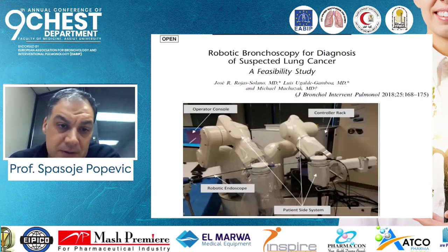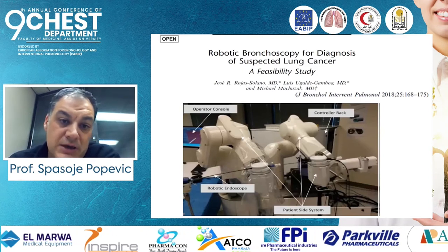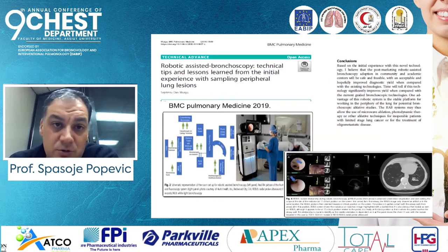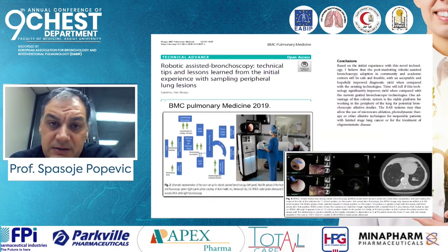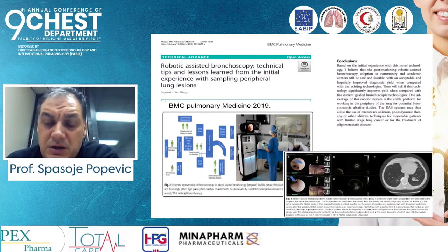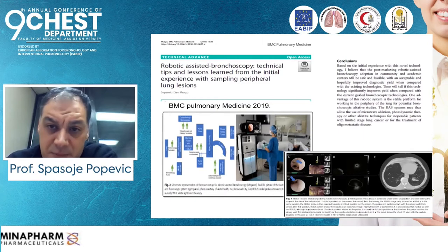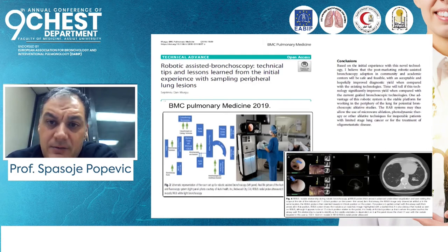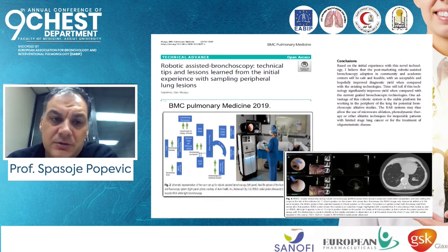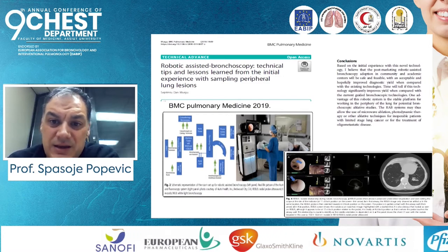And at the end, I would like also to mention robotic bronchoscopy for diagnosis of suspected lung cancer, which was introduced first in clinical use in 2018, but in 2019 it was proven feasible, safe, with a higher diagnostic yield, because it can combine a lot of different navigational techniques in one machine. Also, the robotic-assisted bronchoscopy system can do other things like microwave ablation, photodynamic therapy, and other ablative techniques for inoperable patients, so it can be used for therapeutic interventional purposes also. But the limit with robotic-assisted bronchoscopy is its cost.